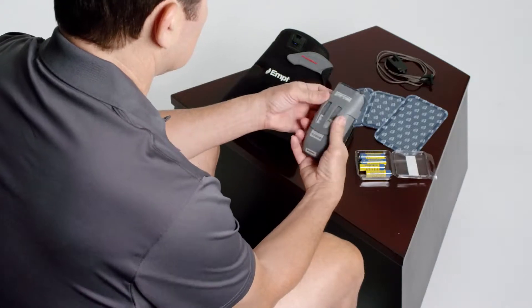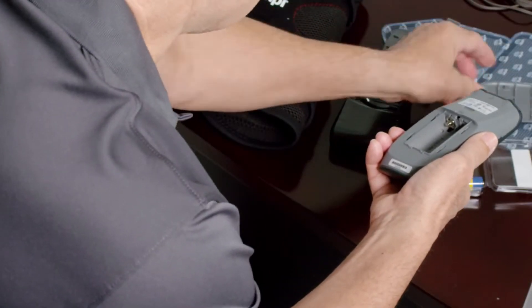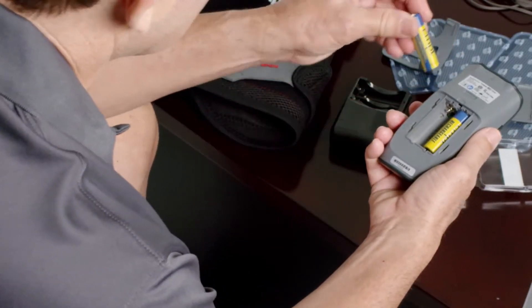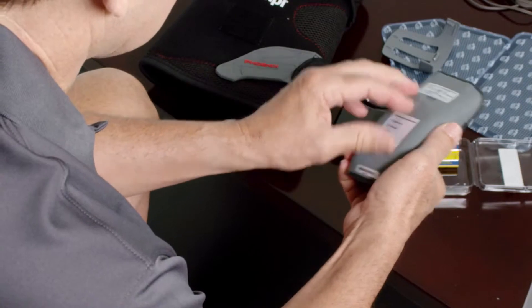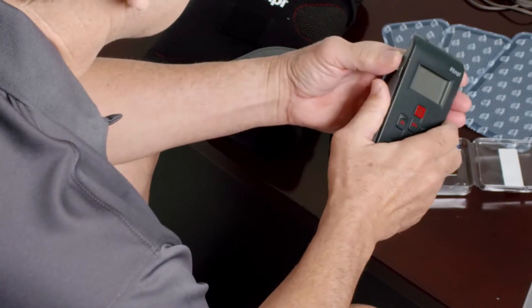Remove the battery cover on the back of the device by sliding it downward. Insert the batteries as indicated on the interior of the battery case. Replace the battery cover by sliding it upward until it clicks into place. If you wish to use the belt clip, attach it to the device.